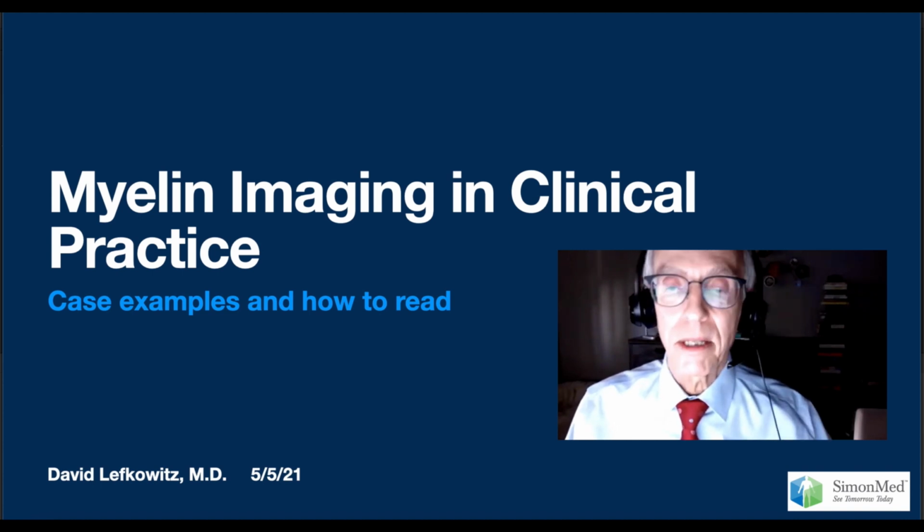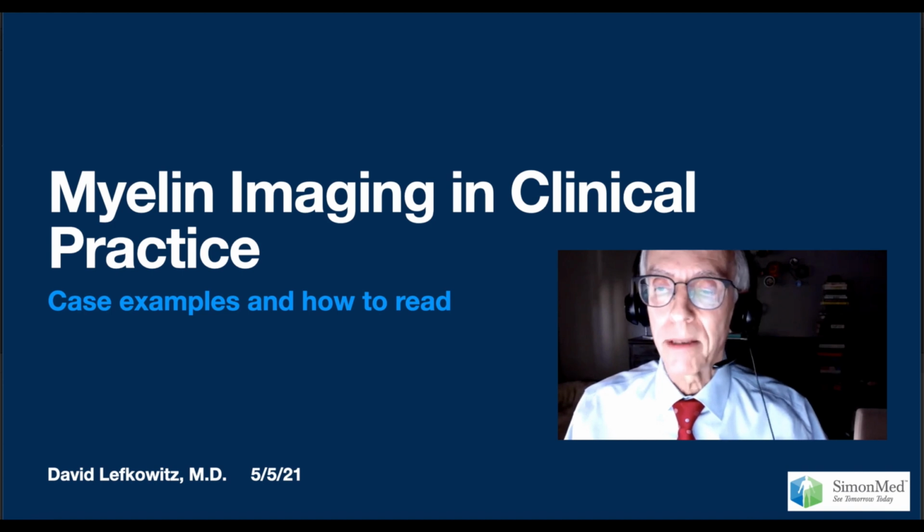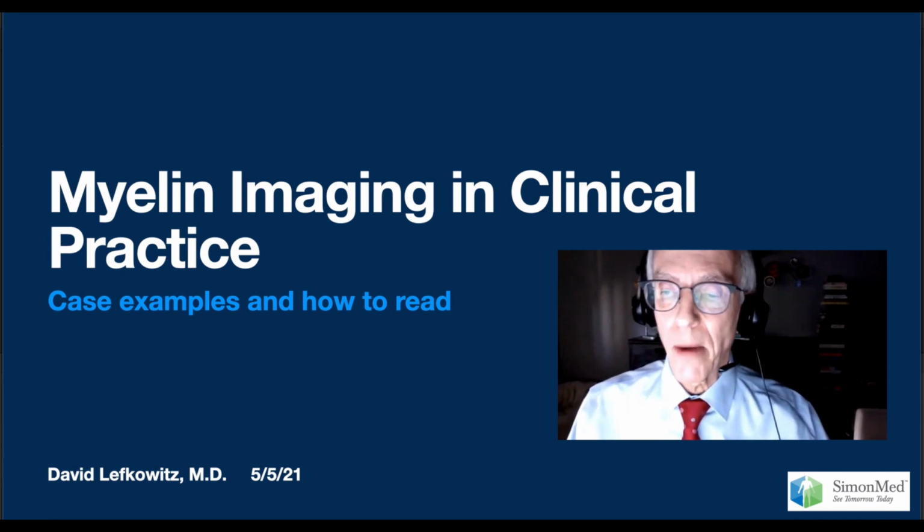This is a short presentation, so it may not be possible to convince everyone in 23 minutes of slides and 4 minutes of 2 case walkthroughs. But the goal is to provide examples of what it looks like, how it works in clinical cases, and how it can be used to enhance reporting.